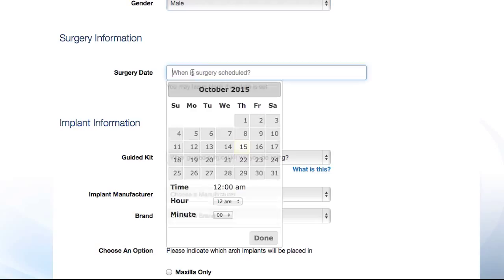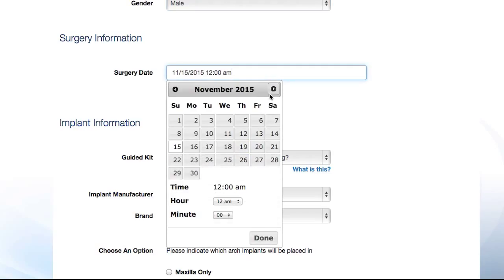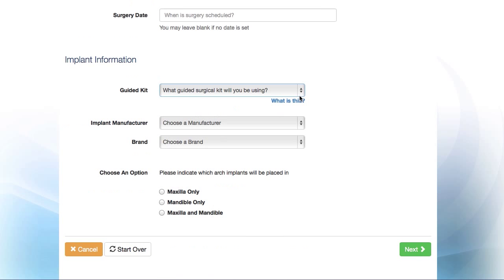If you have already scheduled the surgery date and time, select it here. If not, no problem — you can skip the scheduling tool.